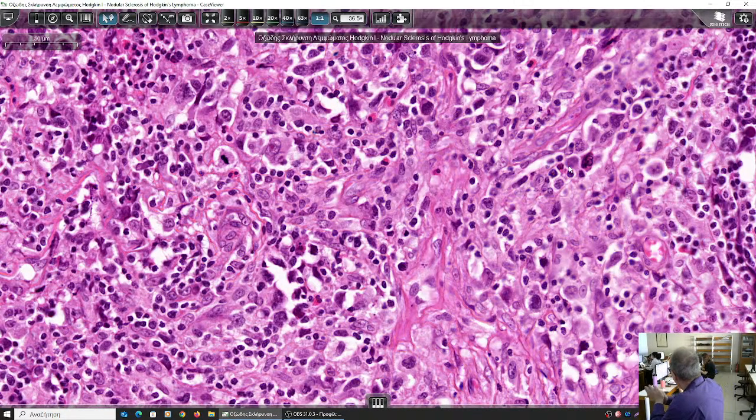So, how do we diagnose classic, I stress this, classic Hodgkin lymphoma? Because we have another type of lymphoma that derives from B cells, so it expresses B cell markers and CD45. But this is not classic Hodgkin lymphoma, as the one we are studying here, the nodular sclerosis subtype, which is, I think, the commonest subtype of classic lymphoma.